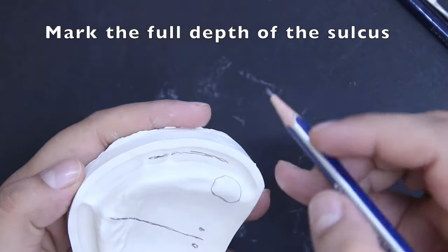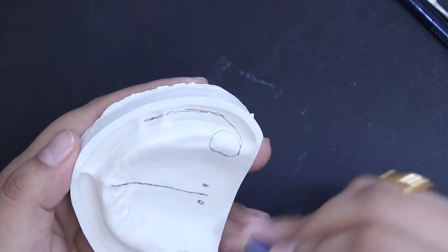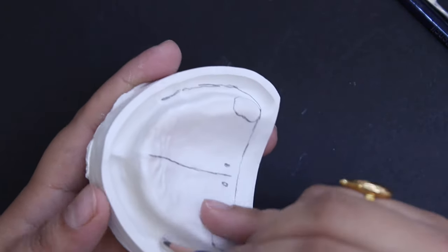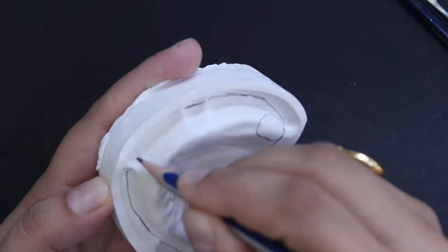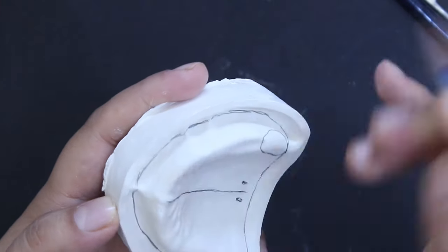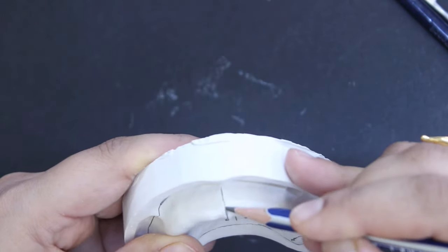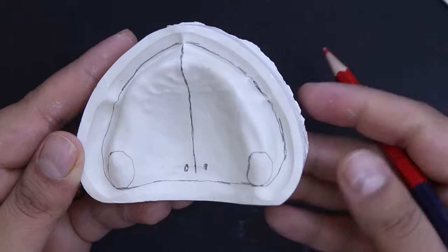Mark the outline of the maxillary denture bearing area. Using a pencil, draw a line that passes in the full depth of the sulcus anteriorly. The distal end of the maxillary denture is marked using a line that passes between the two hamular notches, distal to the maxillary tuberosities posteriorly.